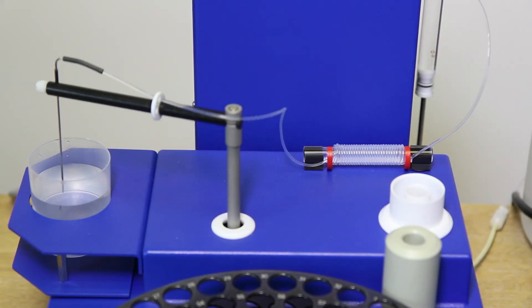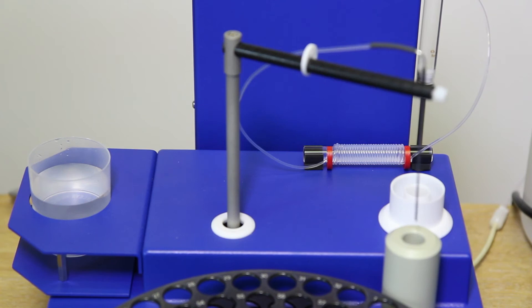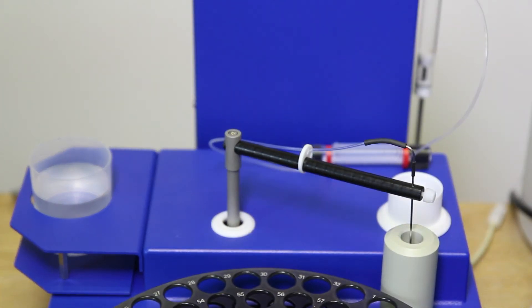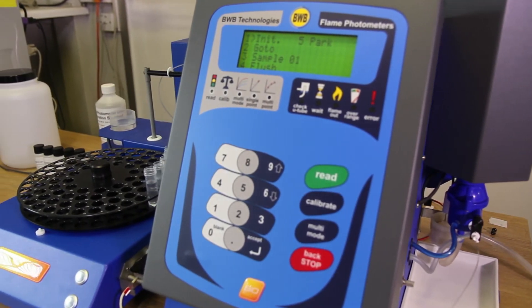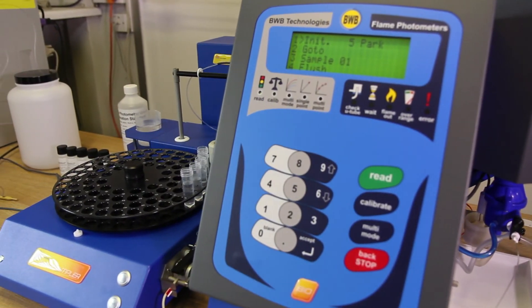The autodiluter reservoir is filled with deionized water, or BWB cesium diluent if internal reference is to be used. For the purpose of this tutorial, we will be using a right-handed BWB bioflame photometer.